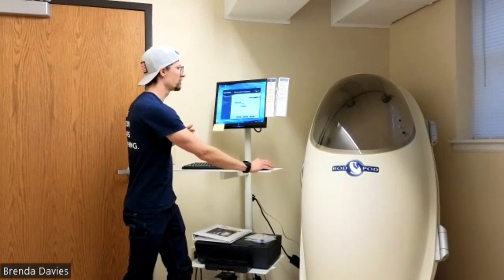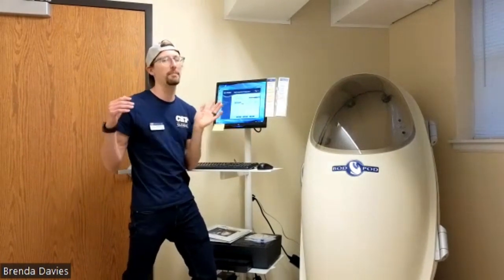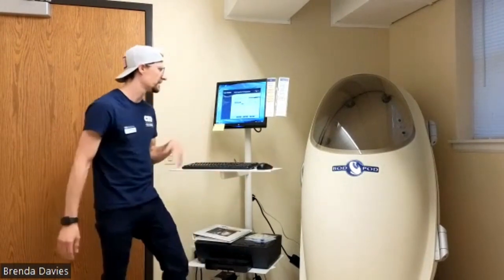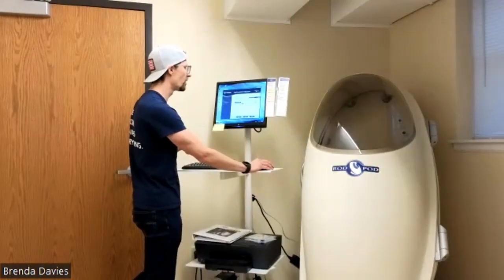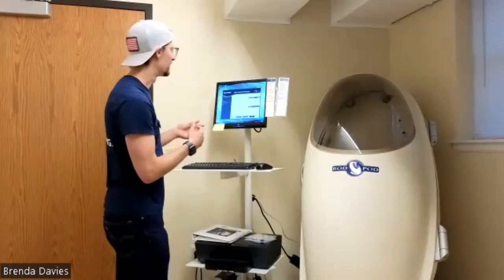So if we wanted to do a measured one, we'd have to hook up a couple of extra pieces within the Bod Pod. Instead, we're going to just do the predicted one because that's what you did last time. I will just be consistent with that for us. So the predicted lung volume for Anna is 3.311 liters. So that's going to again be taken into consideration for the calculation.